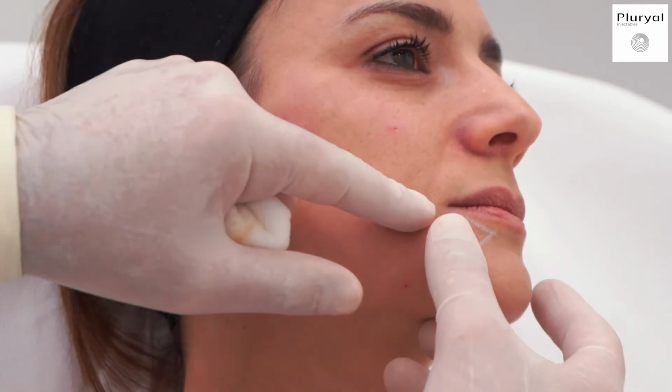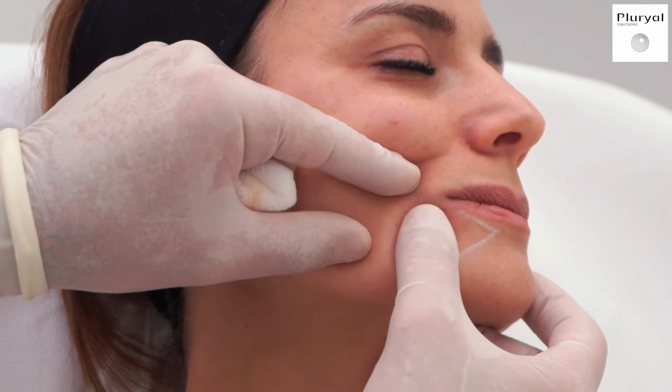I put 0.5 cc's here, and of course I will massage it.